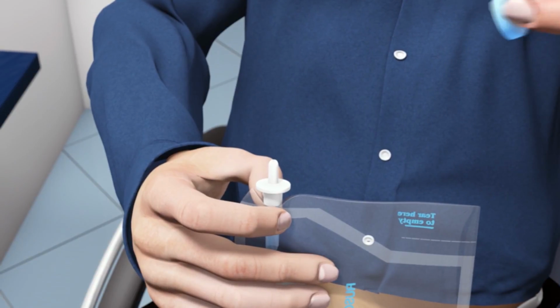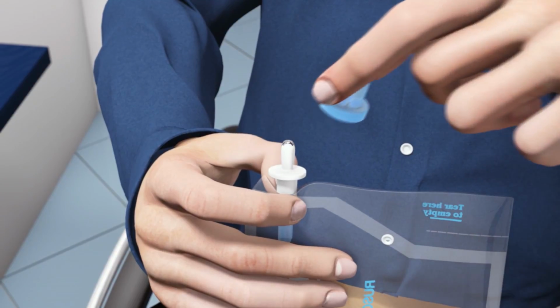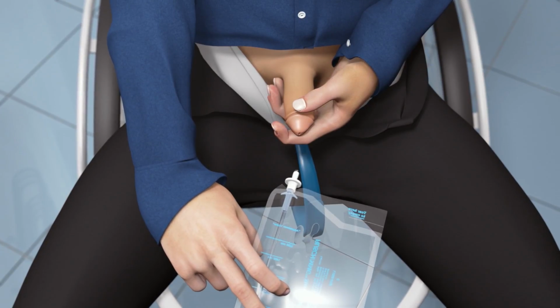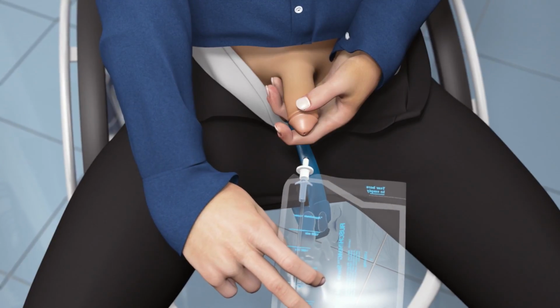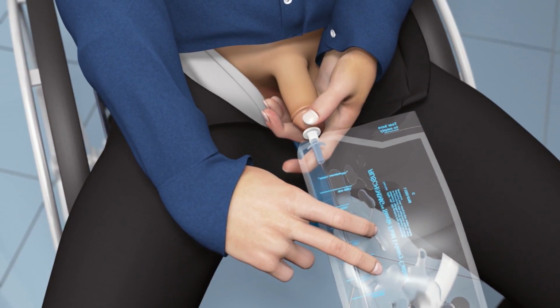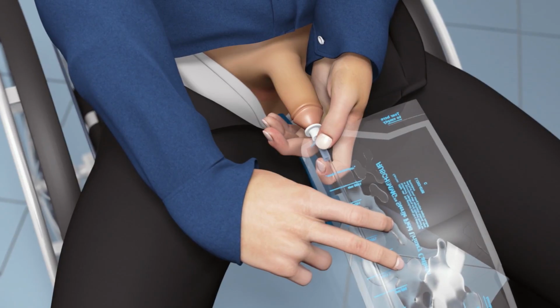If needed, add some extra gel to the introducer tip. The gel can be found inside the protective cap. If right-handed, using your middle, ring, and smallest fingers, hold the penis with your left hand. Insert the soft silicone tip into the urethra opening using your right hand to guide the tip in. Continue to apply the necessary pressure to ensure that the catheter and silicone introducer tip stay in the urethra opening.